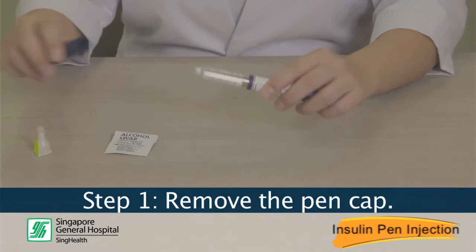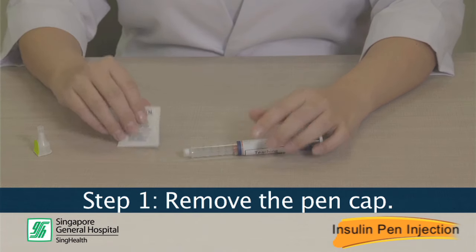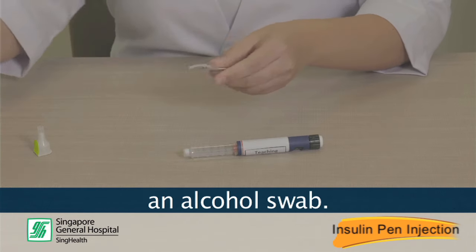Step 1. Remove the pen cap and clean the tip of the pen with an alcohol swab.